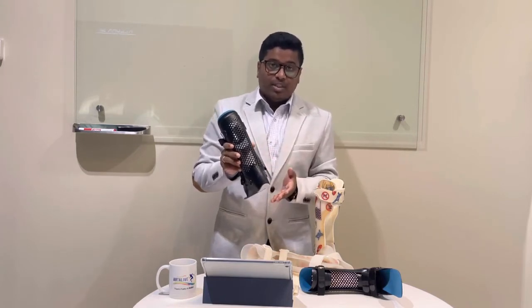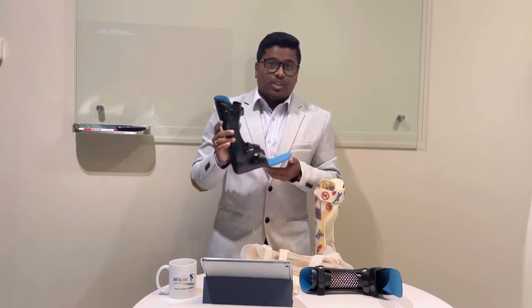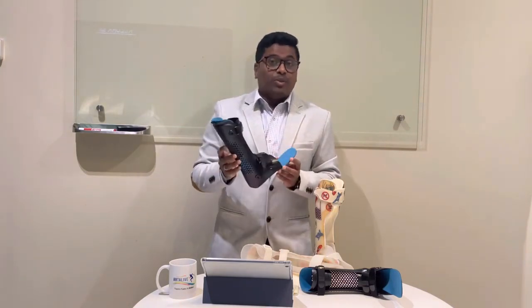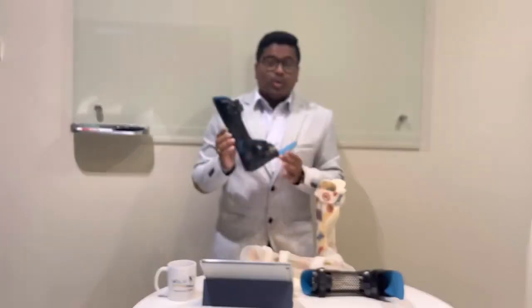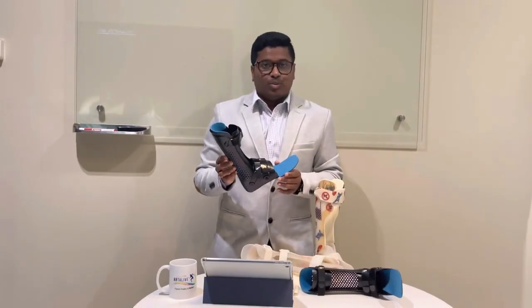After scanning, we do the design in computer software, meaning if a patient needs a particular ankle angle — 85 degrees, 90 degrees, 95 degrees, or 70 degrees — we can correct it precisely in the design. This is a computerized design AFO. I welcome you all to visit our Artha Life clinic for more information about the 3D printed AFO and to have an experience. Thank you so much.